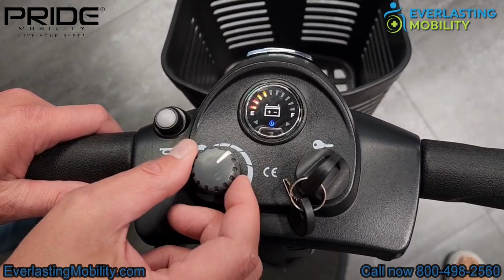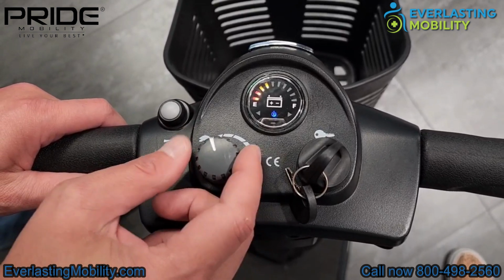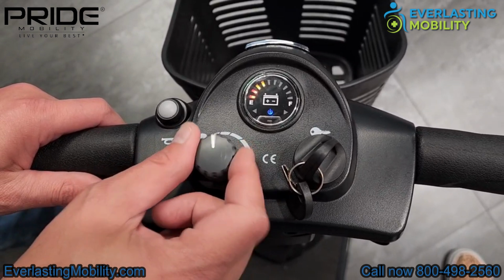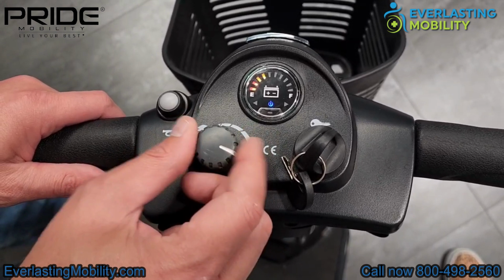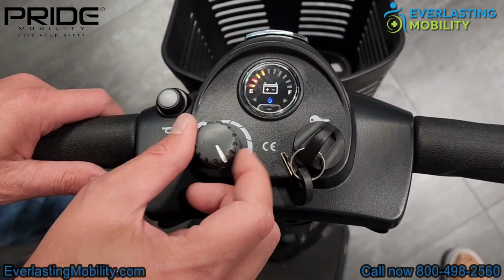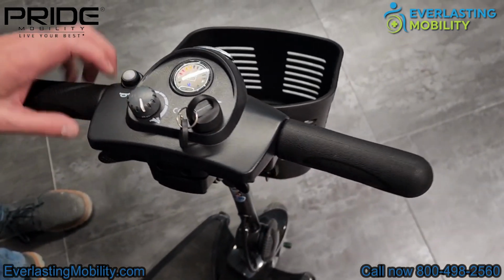But if you want to turn it all the way to the left towards the turtle, that will decrease your speed to about half. And the reason you might want to do that is if you're riding around crowds of people, or you're riding it around a store, it might be a good idea to turn the top speed down. This is where your key goes, and there is a horn on your left side as well.